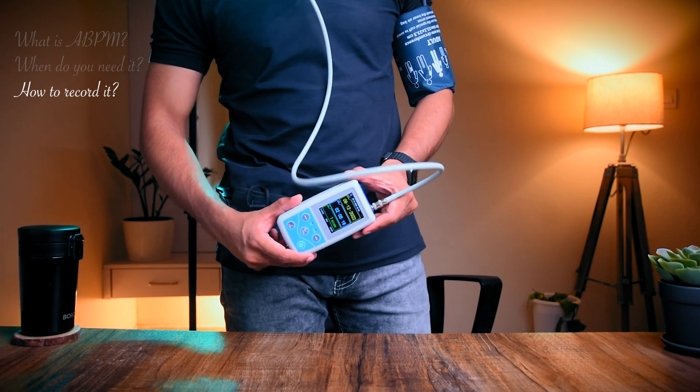The machine records blood pressure every 30 to 60 minutes as per the settings, and it's recorded throughout the 24-hour period. Please do not switch it off at night, as night readings are equally important. Because the test is carried out to find out what your normal daily blood pressure is, it's important to carry on with your normal routine and do all the things that you would normally do.